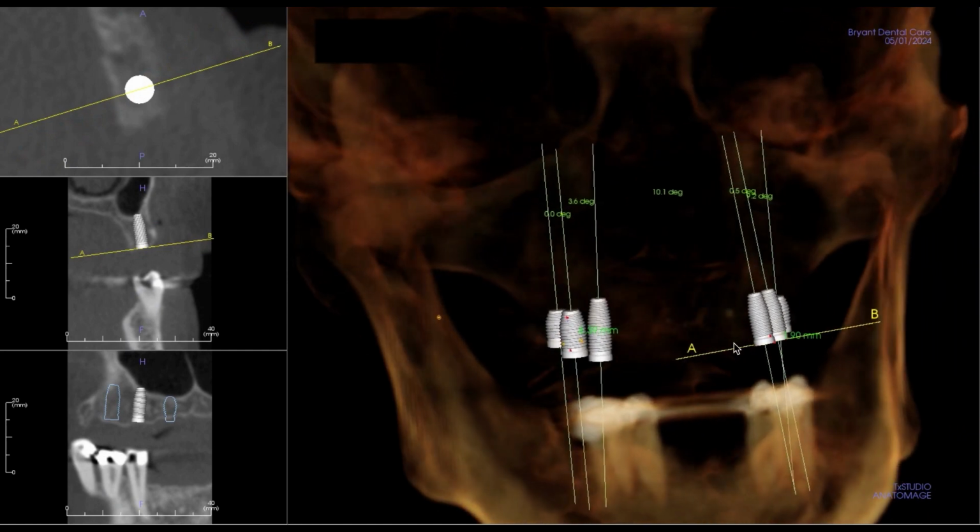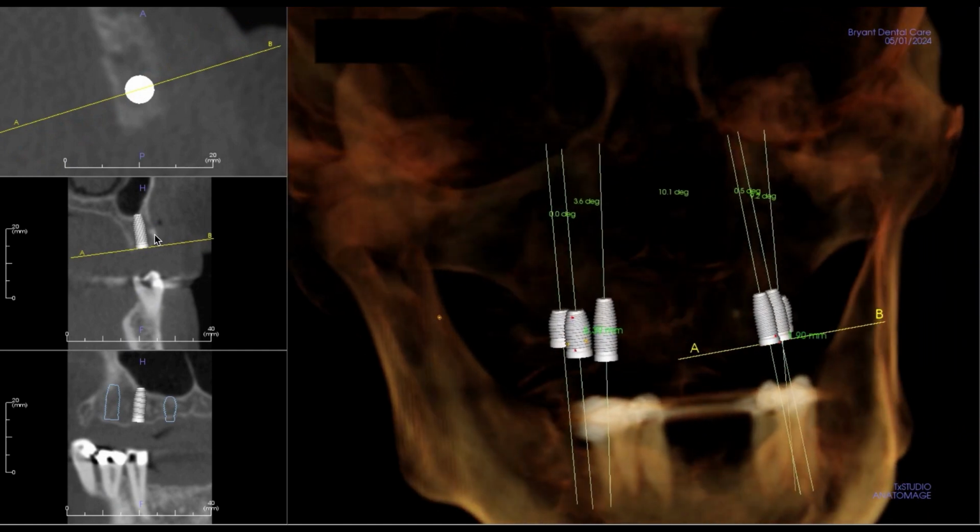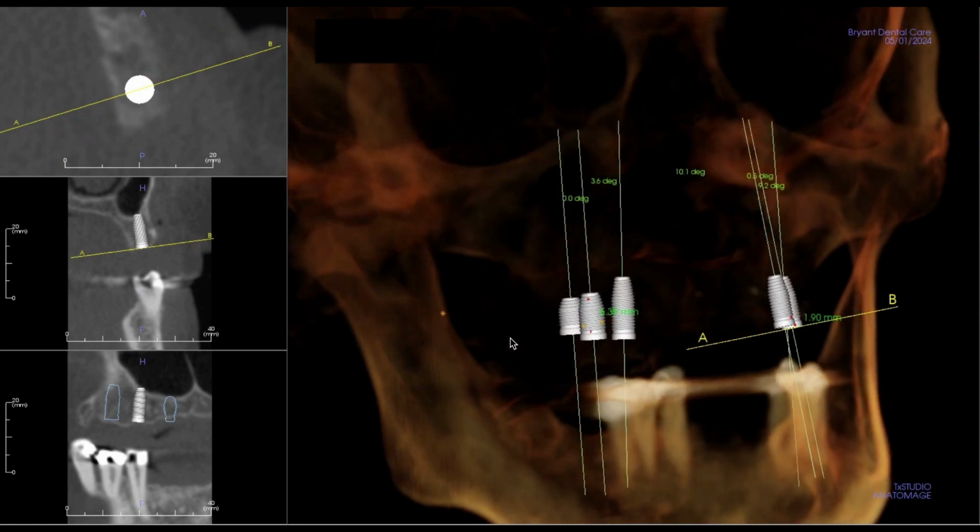Let me start by saying there's some root tips left over. So at each of the sites, you're going to have to be cognizant of that. I would probably lay a flap and just make sure that any of these potential infected root tips are removed and then mildly grafted, before or after closing up the case, before the implants get placed, and after you close up the case, just ensure that it's all gone.